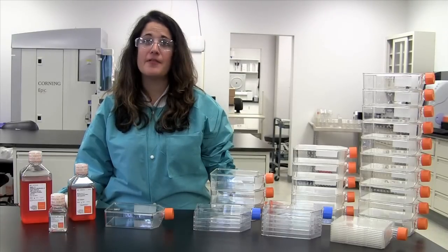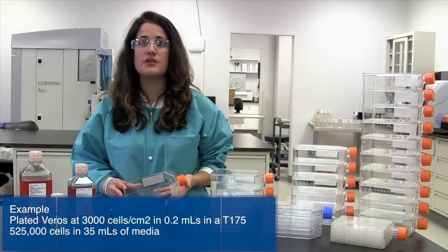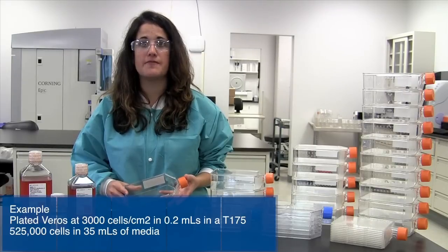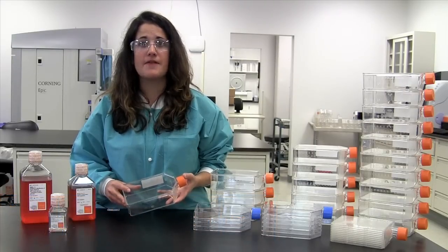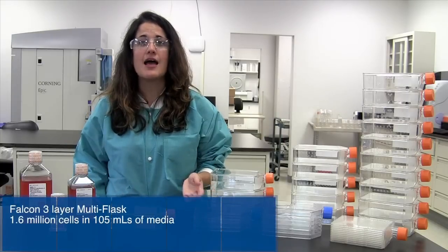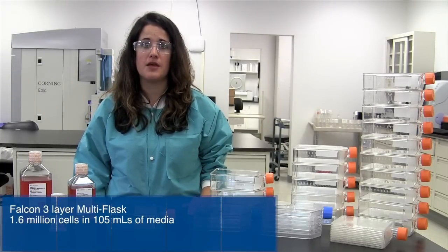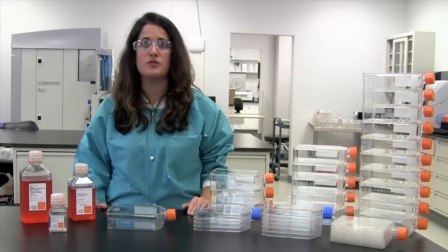For example, if I plated Vero cells at 3,000 cells per cm² and 0.2 ml of medium per cm² in a T175, I would need 525,000 cells in 35 ml of medium. If I then expanded the cells into a Falcon 3-layer multi-flask, I would need 1.6 million cells in 105 ml of medium to maintain consistency between the vessels.